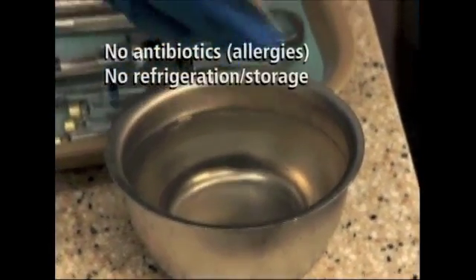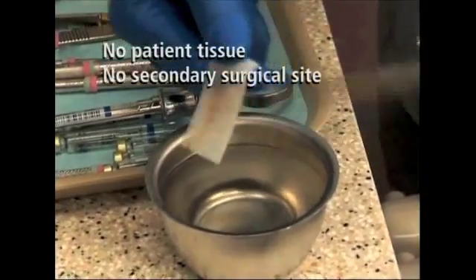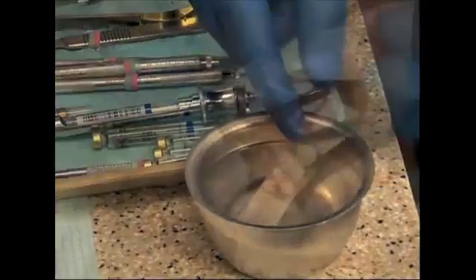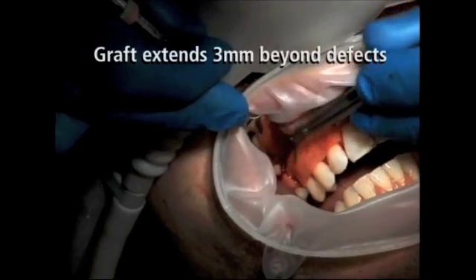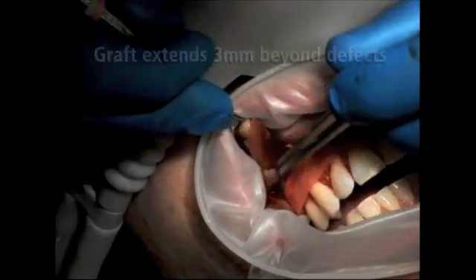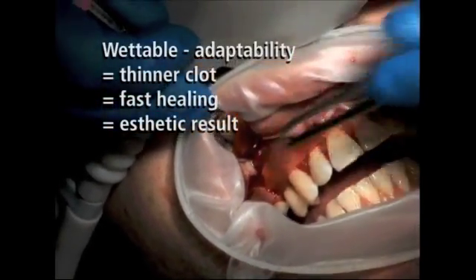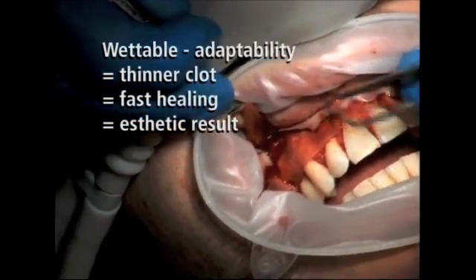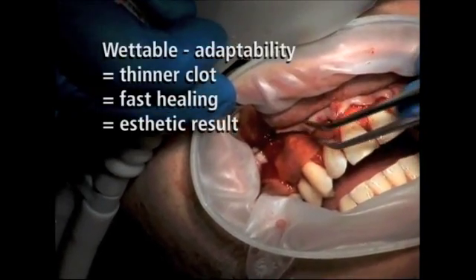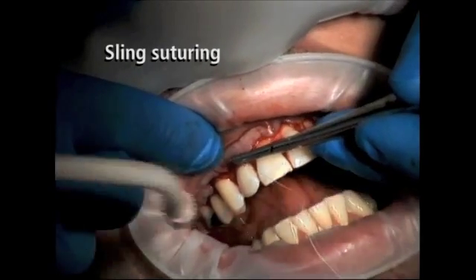Once the perioderm has been thoroughly hydrated — which only requires about 3 to 5 minutes — the perioderm is trimmed and taken over to the recession defects. Although there are two sides to the perioderm, I have not found its orientation to affect the success of the graft procedure. While fitting the graft over the recession defects, it is important that you have enough material to extend at least 3 millimeters beyond the dehiscences. You will immediately notice how the graft material absorbs blood, which is in stark contrast to similar products, and how easily adaptable the material is over the root surfaces.